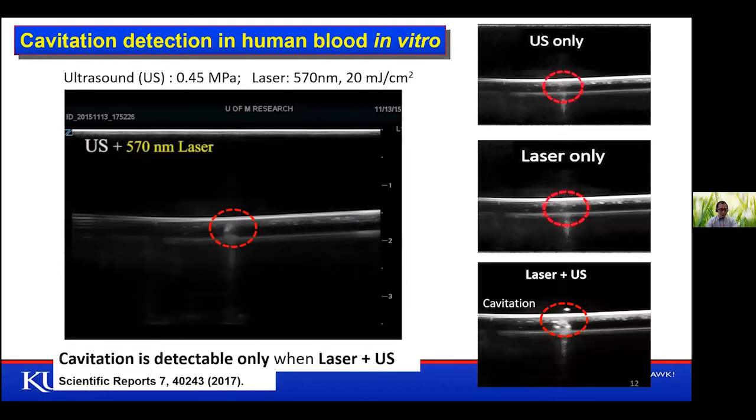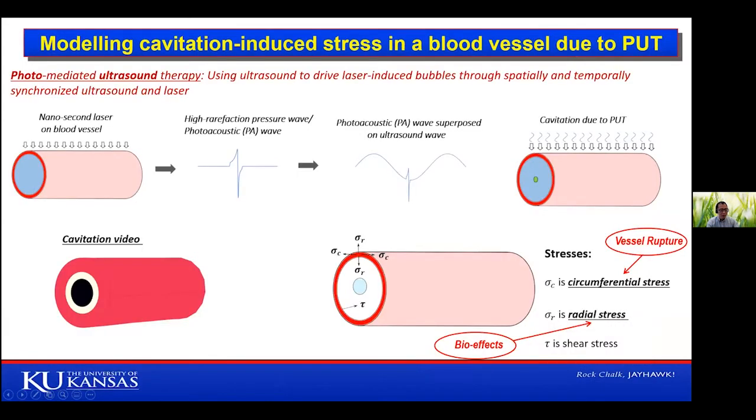From this imaging, it really shows that when you have laser plus ultrasound together, you do have detectable, strong, much more enhanced cavitation activities. And so from that, we went on to do more numerical simulation. If we have this enhanced cavitation, what can this cavitation do? What is the effect of this cavitation on a blood vessel?